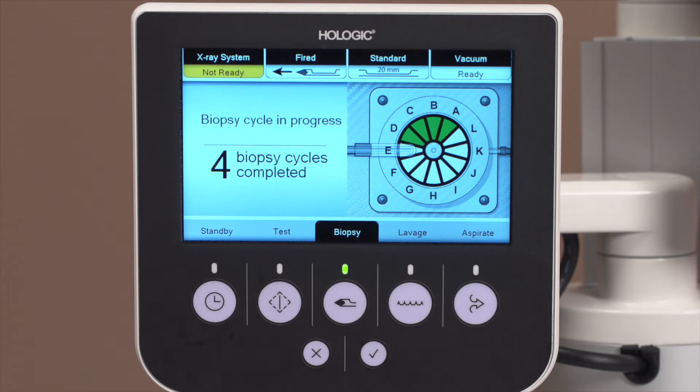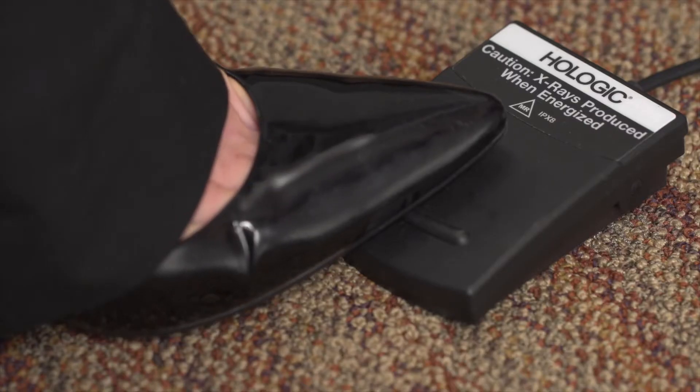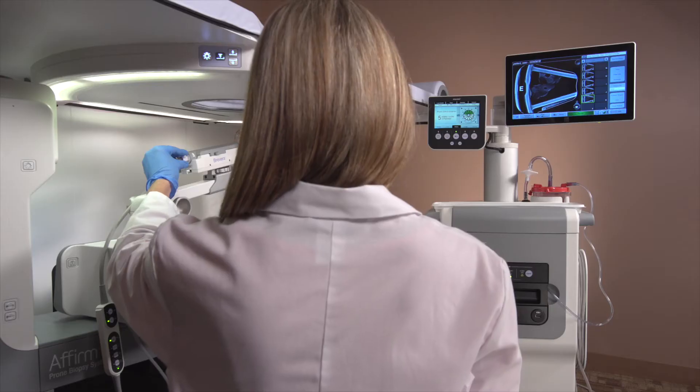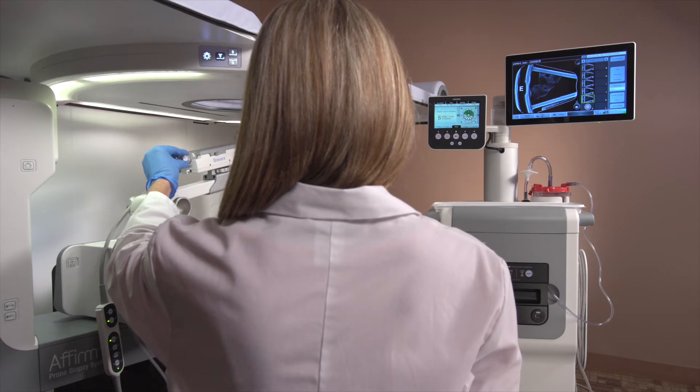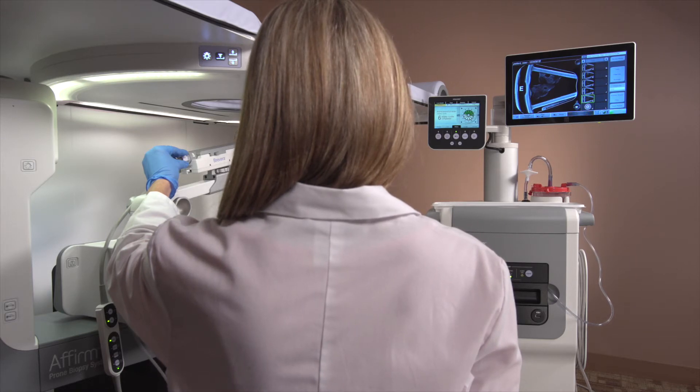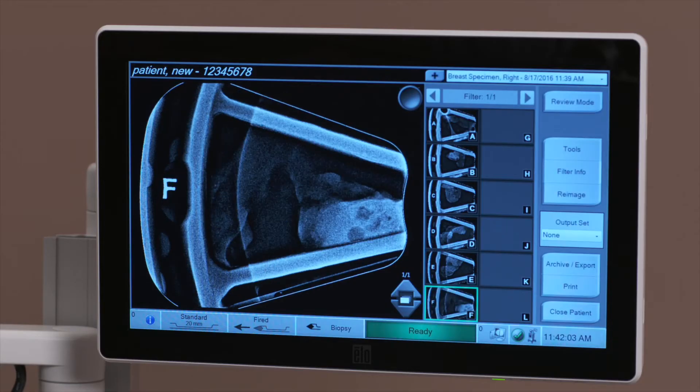The technologist display will update to the next specimen when the biopsy cycle is initiated. The physician will remove their foot from the foot switch during the last desired sample to complete the biopsy cycle and imaging. The system will continue until the last cycle and image is complete.